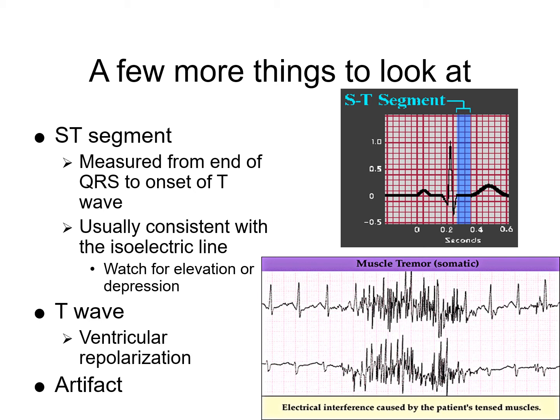If you're doing chest PT, either the old-fashioned way or with a percussor, that can also cause artifact like that. Sometimes that gets the nurses a little excited and they come running into the room because they're seeing that on the monitor. It's just you. It's your fault.